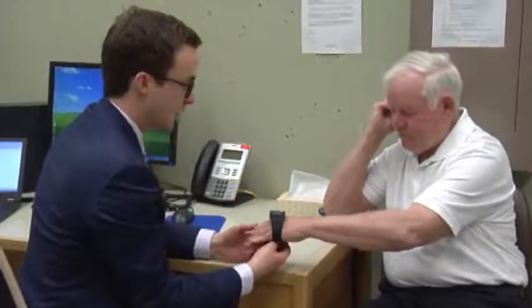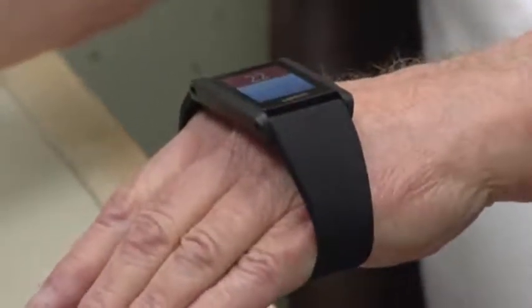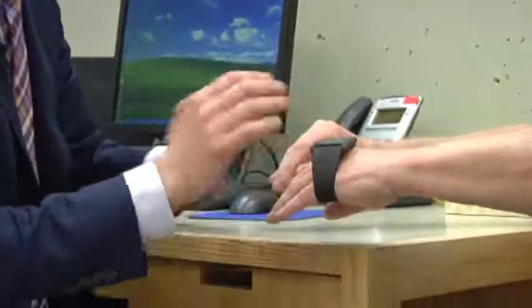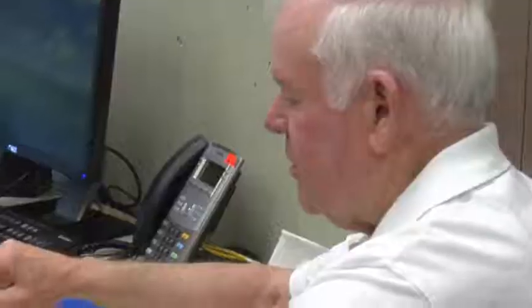All the smartwatches and these little bands nowadays have those accelerometers built in. And so my idea was, can we actually use that kind of technology to translate into the clinic something that's diagnostically useful? The reason I use a smartwatch is it's very light. The module is only about 20 grams, whereas the smartphone's usually about 180 grams or something like this. And so that can actually change the mechanics of the tremor if you weigh the hand down a little bit. So I wanted to use something as light as possible.